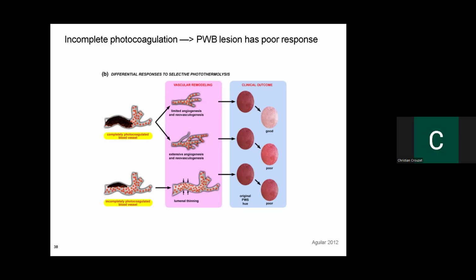Typically with LSI, most of the entire signal is within the first 500 microns to 1 millimeter of tissue. It would be really rare to go deeper, so it's much more at the capillary level that is being resolved. Especially in skin, it's more of a perfusion measurement, whereas in the rodent brain, you can actually see some of the larger vessels because they're exposed.